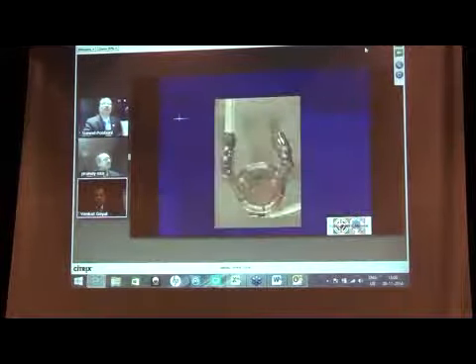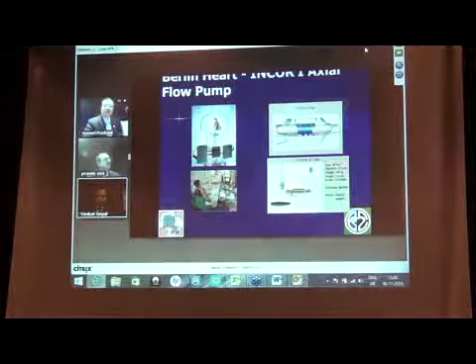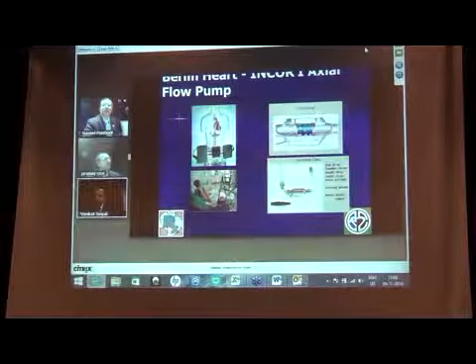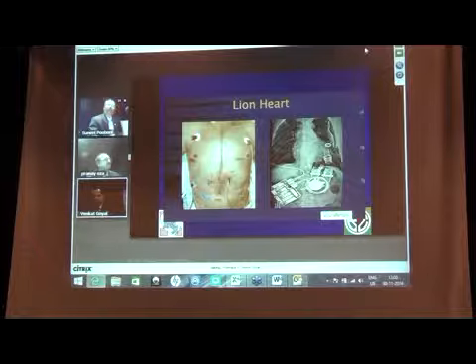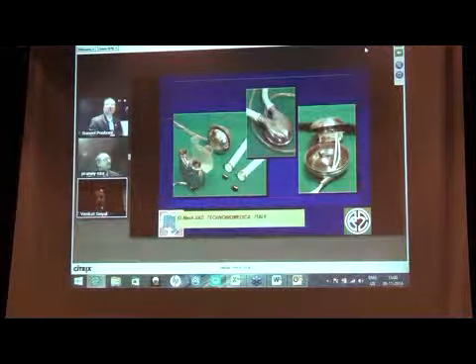And then one was the efferent and one was the afferent. The blood was sucked in from the apex of the LV cavity and was put into the artificial chamber and was returned back to the aorta. Therefore this was acting like an isolated left ventricle. And this is a photograph of the motor, which is a magnetic driven motor. The blood is not in contact with the axle anymore, and the magnet drives the motor, thereby pumping the blood. And this is the X-ray picture, and finally this is a picture of implantation, the position of the sutures on the chest, and these are the various components. This is the position, how it looks.